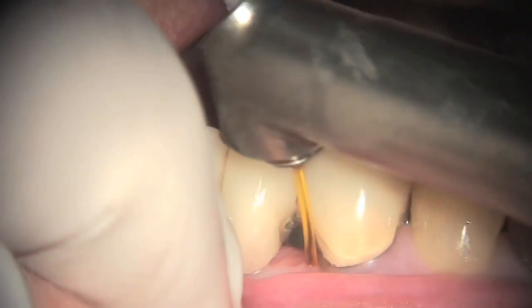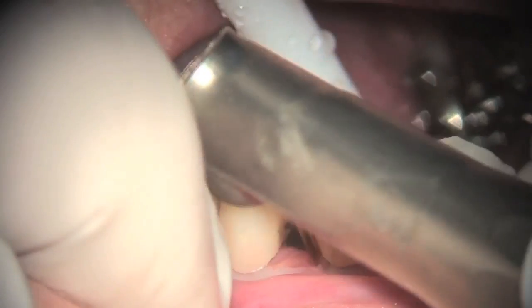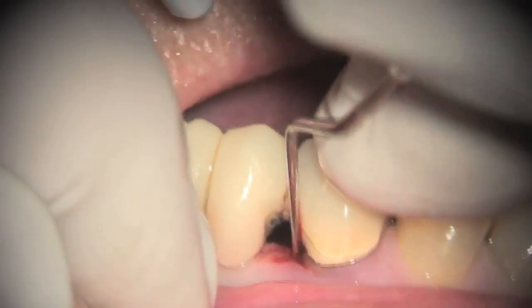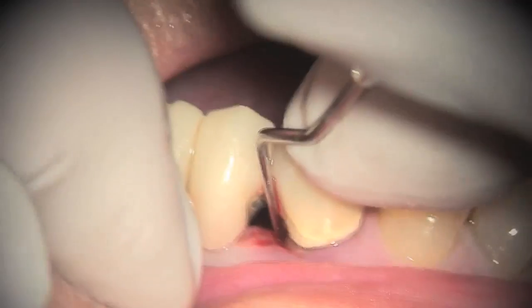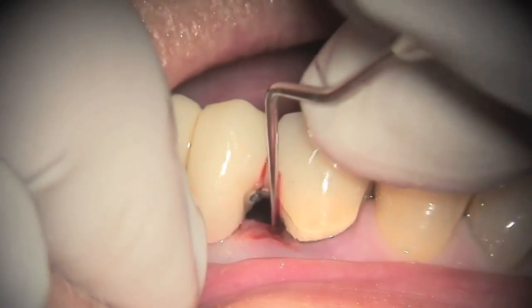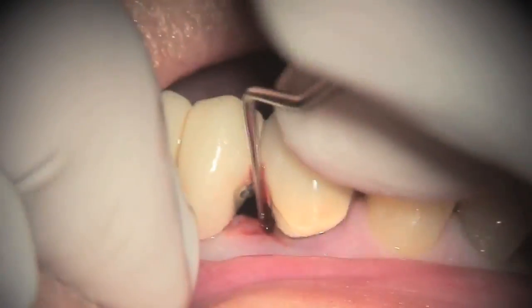Now dissect the periodontal attachment down to the bone. This will release the regenerative factors that are needed. An endodontic explorer is used to decorticate the bone, which provides angiogenesis to supply the clot, and also to enhance the regenerative factors coming from the bone.